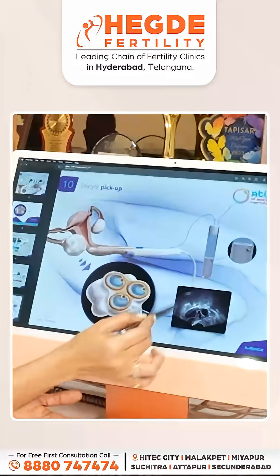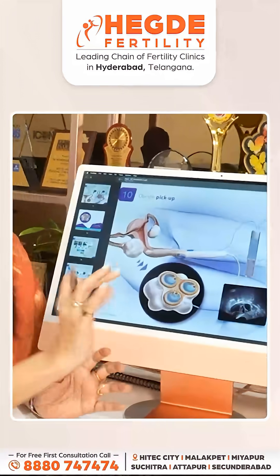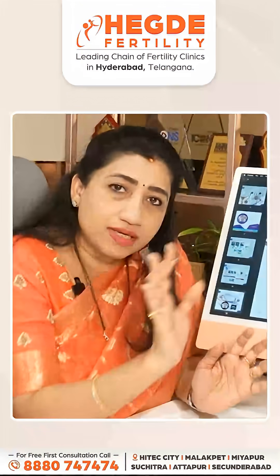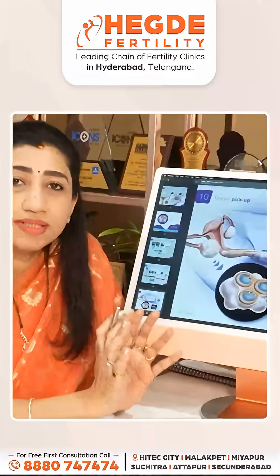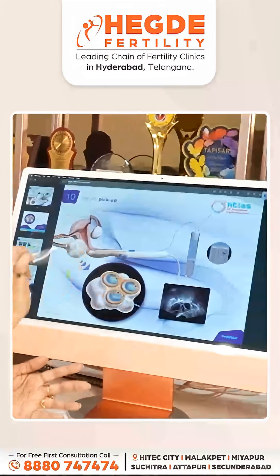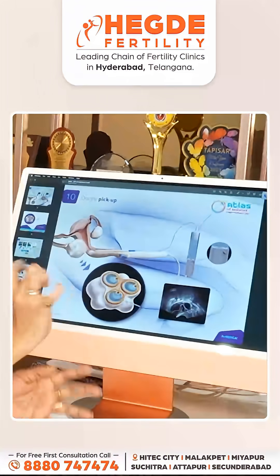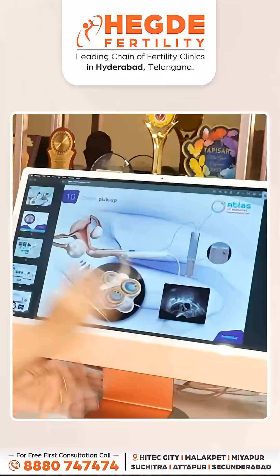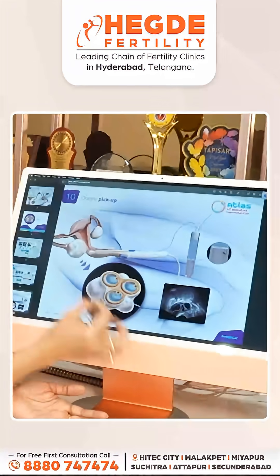In the scan, the ovaries can be visualized and the stimulated follicles can be identified. In the pick-up procedure, the follicles are aspirated. The goal is to enter every follicle — right ovary and left ovary. Under scan guidance, we choose the needle and enter every follicle.